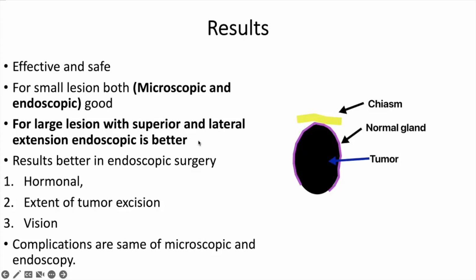The tumor resection rate of large lesions using the endoscope is better, as are hormonal control and extent of resection.